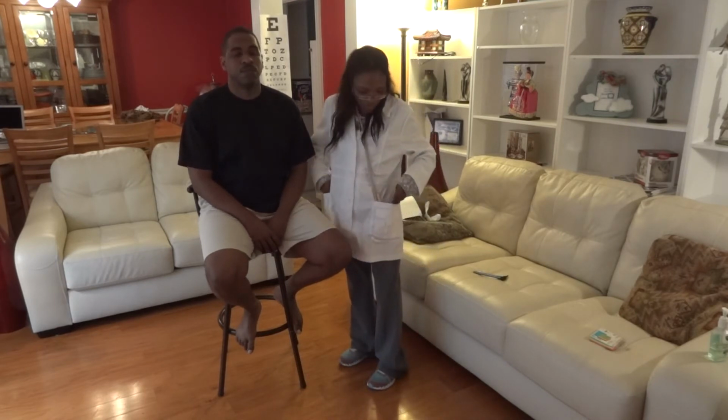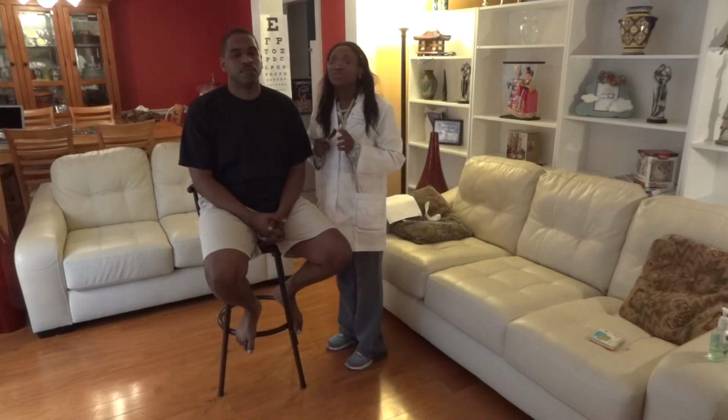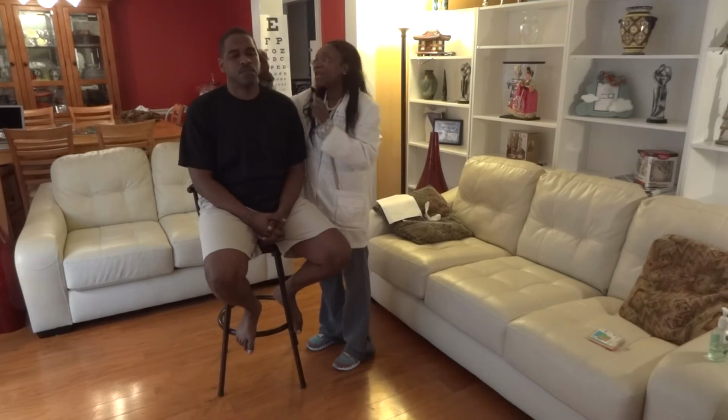And so what we are going to do now is look into his ears. We've already inspected the outer ear. We've palpated the outer ear. And so now we are going to look into the middle ear canal. What you want to do in an adult patient is to pull the pinna up and back.